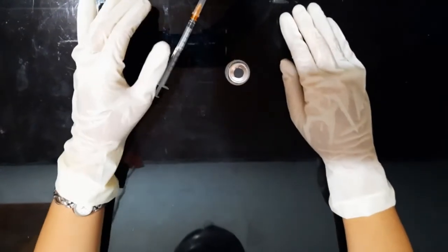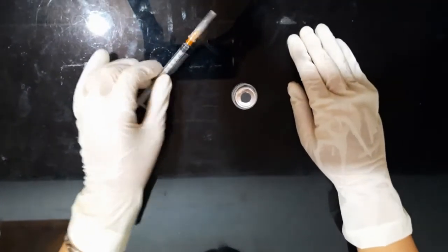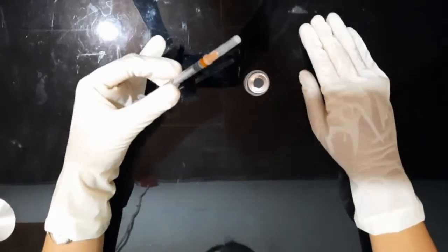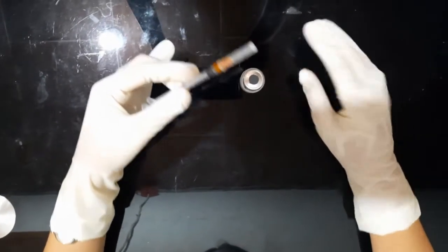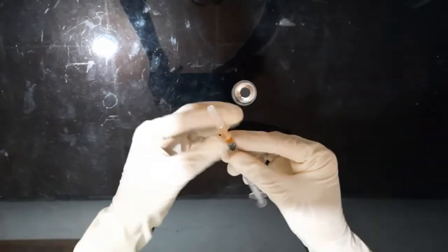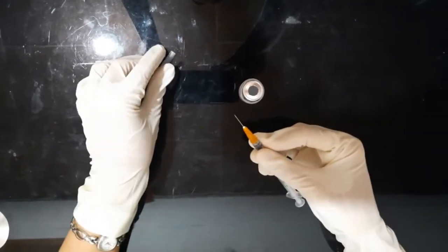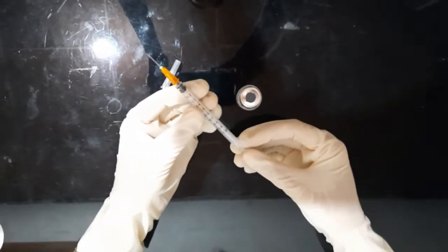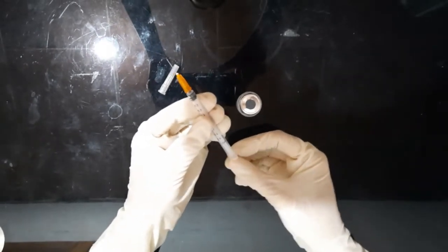and we're going to draw back our air, and the amount of air we draw back is the amount of fluid we're going to take out of the vial. So let's say for pretend it's 0.3. So we're going to pull back to the point 0.3 of air.